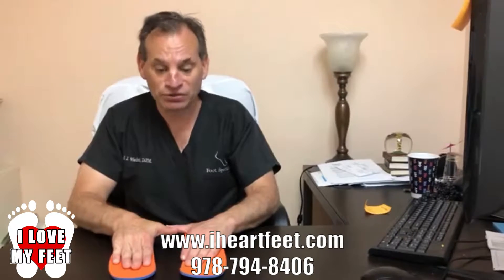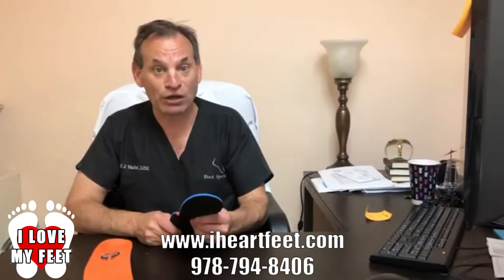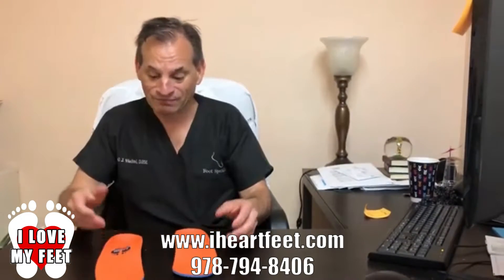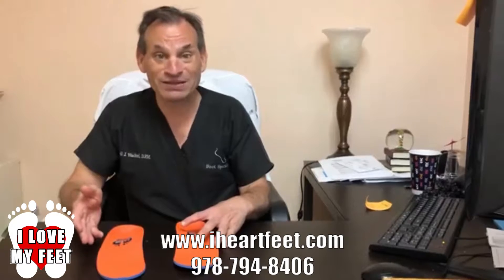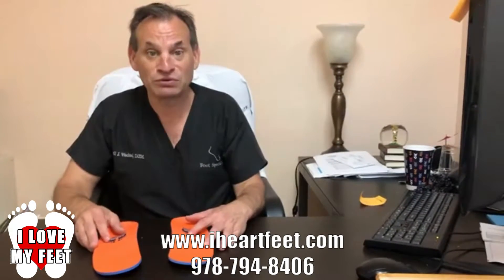We need our foot to be supported well. As you can see, we cannot move the arch — watch. These fit very well in most sneakers and walking shoes, and the greatest thing about it is basically they're inexpensive, and you can buy several pairs that will fit into most of your shoes.